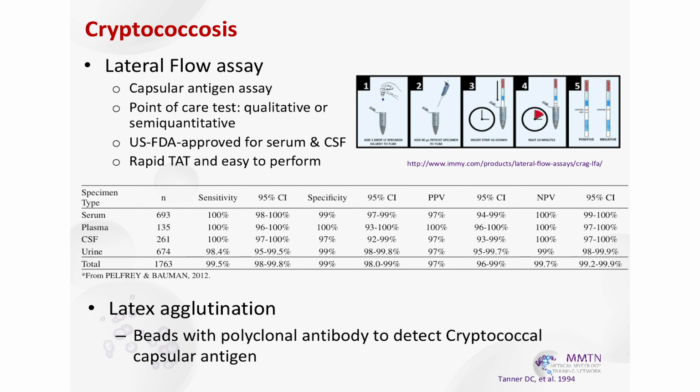This is already a WHO recommendation. I think every hospital here and also in China already uses LFA. It costs about 150 baht, might be about $5. I don't know about here. However, because of the cost, in our hospital we use it only for screening, not for the titer, because it's too expensive. We cannot afford it. So after we get a positive or negative, we then do latex agglutination for the titer. This is what we practice.